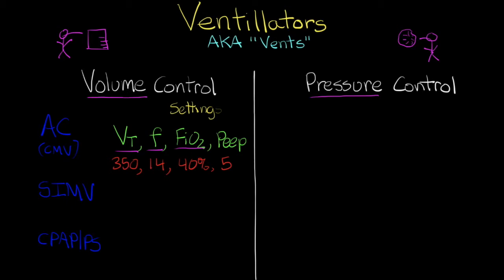And it's important to note that as our FiO2 increases, once we get above 60% and we start to have patients at this level for extended periods of time, we begin to worry about damage being caused to the lungs. In terms of the pathophysiology behind what is happening, we won't discuss that here. We'll save that for another future lesson. But just know that once we start to go above 60%, long term we do begin to worry about the damage that the high oxygen is going to be causing to that patient.